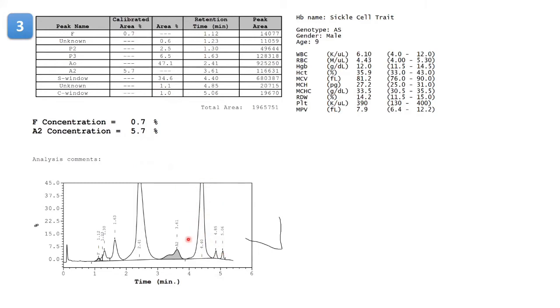So here the products, that is glycated, acetylated hemoglobin, of sickle cell hemoglobin are co-eluting along with hemoglobin A2, causing false elevation of hemoglobin A2. Just because there is elevation of hemoglobin A2 doesn't mean this is a compound heterozygous state. This is nothing but a sickle cell trait.